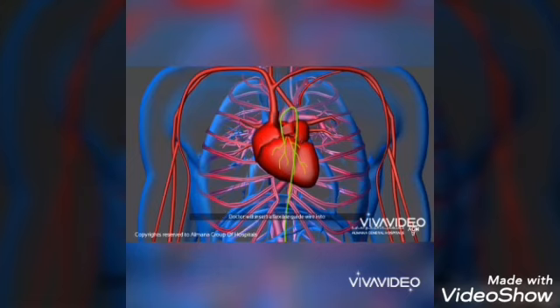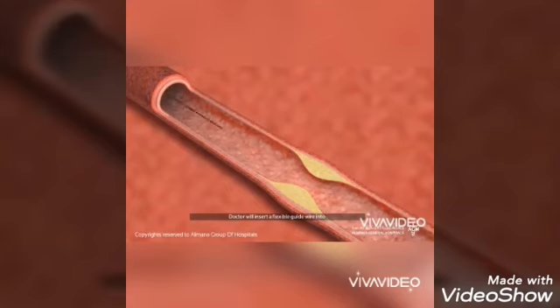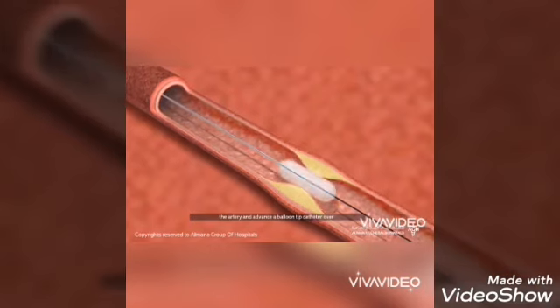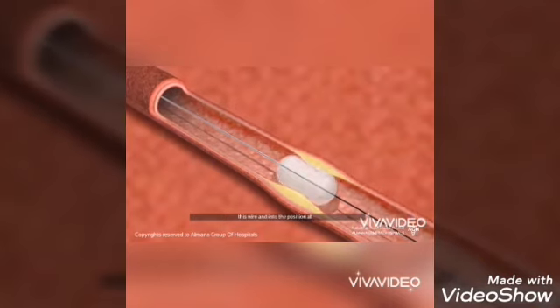After monitoring the location of the blockage, a flexible wire is inserted with a special balloon at its beginning into the artery, directing it to the site of the blockage. Then the balloon is inflated repeatedly inside the blockage area to push the artery wall and restore blood flow inside the artery.